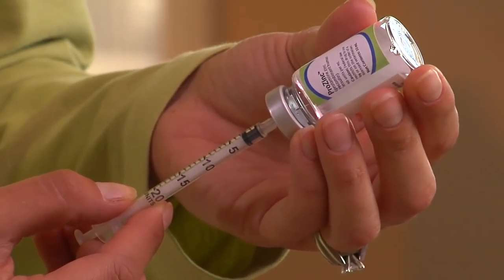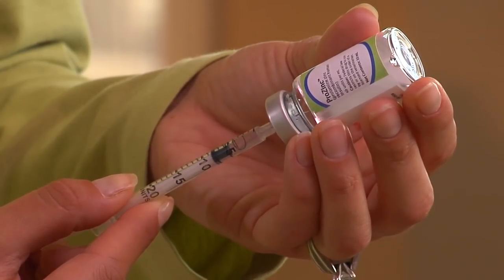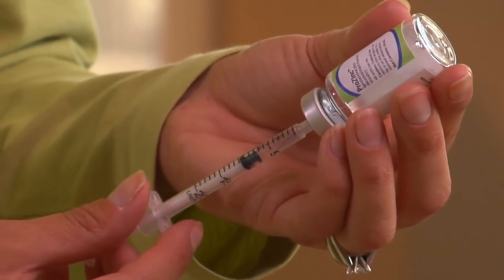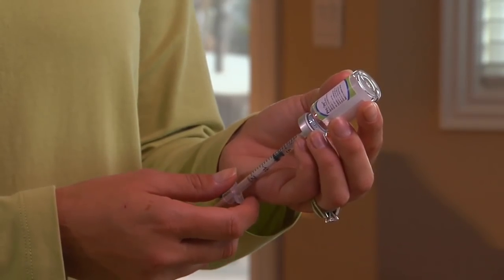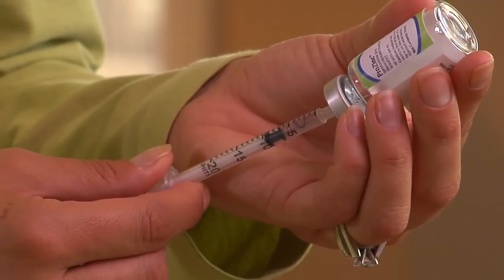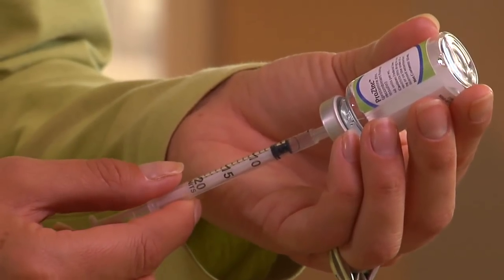Now slowly pull back the plunger again, but this time go a few units past the dose. You can see Lisa drawing about seven units into the syringe. While you still have the needle inserted in the vial, look for any big air bubbles in the syringe. If you see any, just tap the side of the syringe gently with your finger to release them. Now slowly push the plunger back to the prescribed dose — in this case four units. Take your finger off the plunger and pull the needle out of the vial.